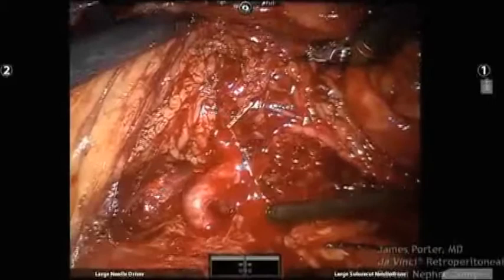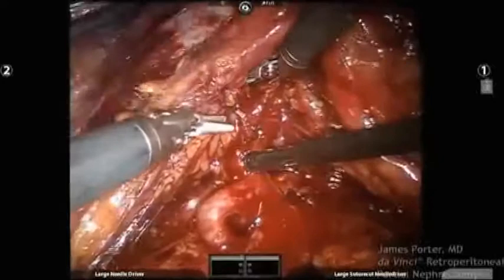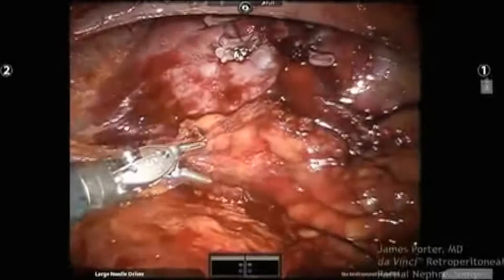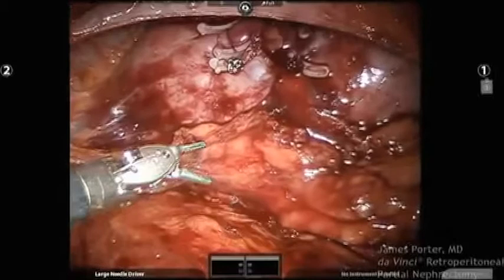Yeah. Eric, any experience in taking the clamp off the vein in that situation? I was going to say, I usually work through it, but it's interesting. There are times when you take that vein clamp off and it just totally stops. You have an egress for that blood to drain that kidney, and that bleeding from the parenchyma stops. So that's obviously a trick that you can use in your back pocket if you can't work through it, but generally most of it is tolerable.